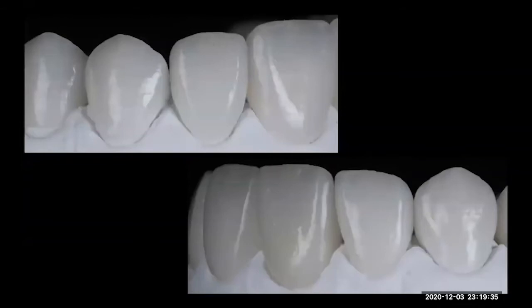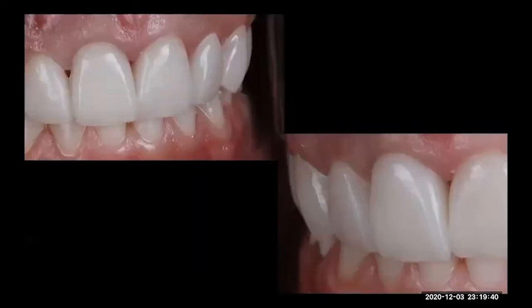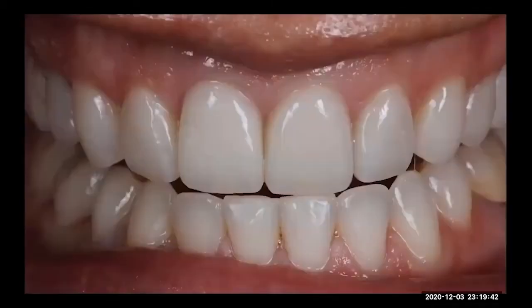This is the case finished in the solid model. And this is our try-in, okay? And this is the case like 6 months later. You can see all the effects you see in the incisal edge are from palatal. But the beauty of this case is we have some vitality in the incisal edge, and we have the value control. You can see that this is like a 1-in-1 BL4 color, and still we have a nice value control, but we have some vitality in the incisal edge.